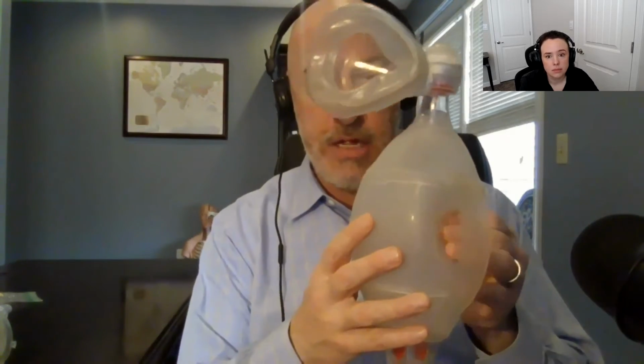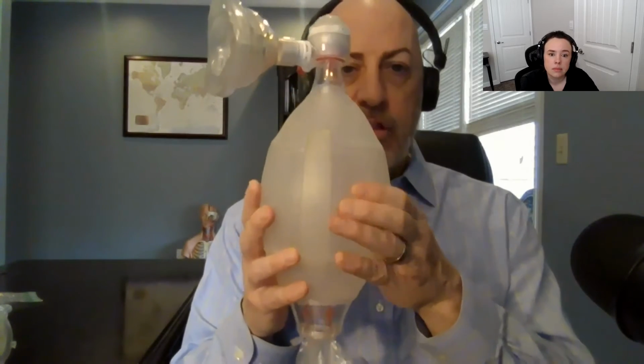So the question is, how do we fix the rate? Once again, you can be very disciplined. Let's say you want to breathe at 12 times a minute. You can squeeze and then count 1,000, 2, 1,000, 3, 1,000, 4, 1,000, 5, 1,000, and do that. The thing is, you might be very disciplined at that because you watch this podcast. But then you hand the BVM off to somebody, and they may go back to doing this because they didn't pay attention to this podcast or didn't watch it. So there's other ways to fix the rate problem.